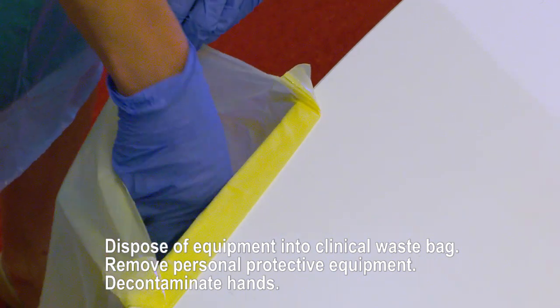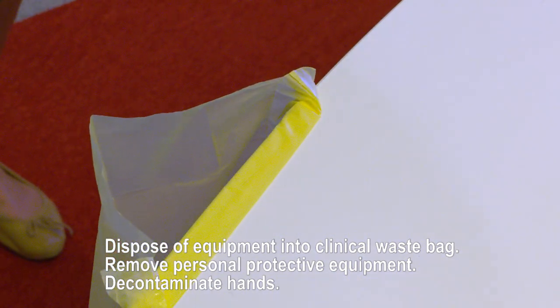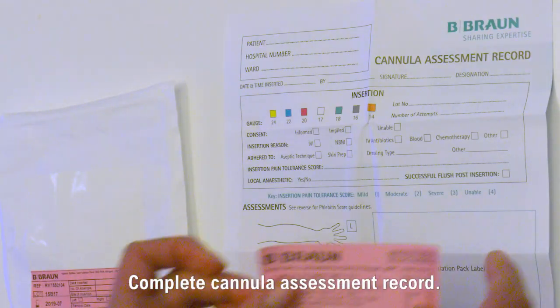Dispose of equipment into the clinical waste bag and remove gloves and personal protective equipment. Decontaminate hands and complete the cannula assessment record.